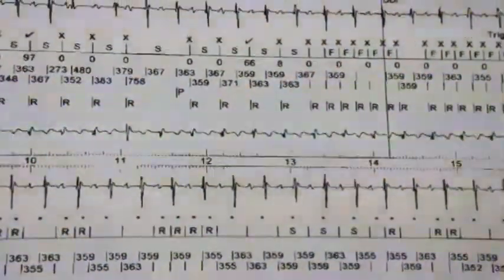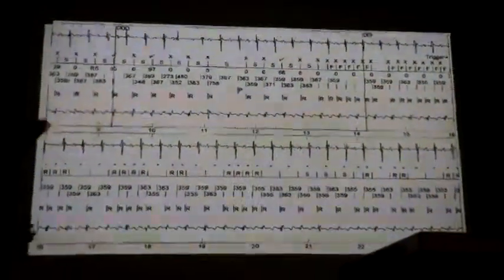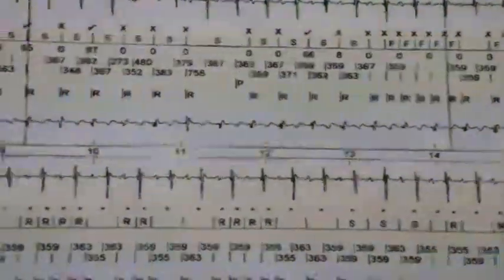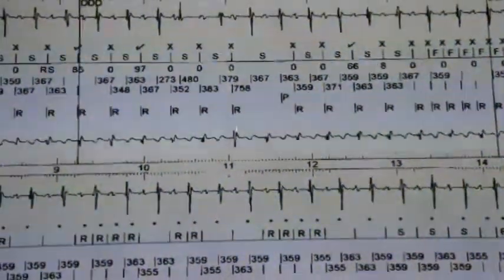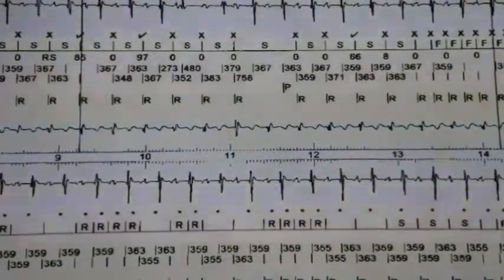So we considered that programming, but look, these T waves are nearly the same size as this R wave. So if we hide the T wave, we will probably hide an R wave, and we're already not sensing some R waves. This is an R wave that's not been sensed really because of this signal here. Yeah, this signal made this not be sensed. It's normal, we can see this sometimes.